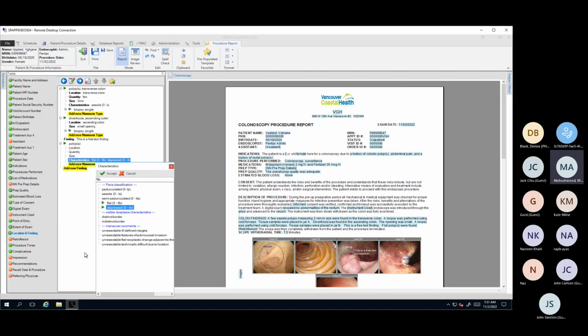From there, we see what we can add and what we can't, what's doable and what's not, and we go ahead and configure some of this content for you. That's how we envision this looking.